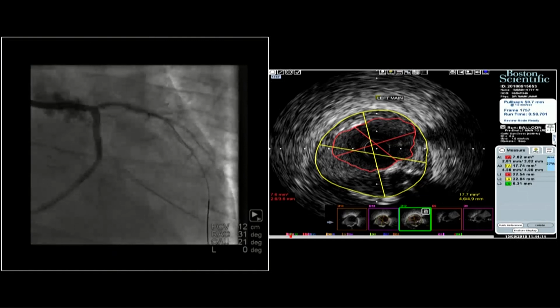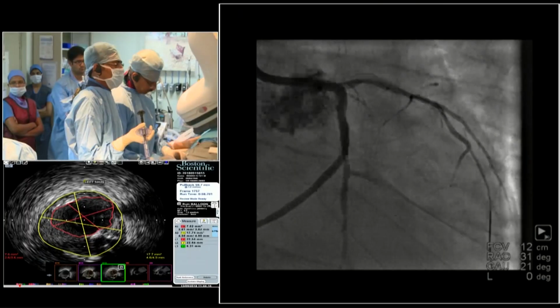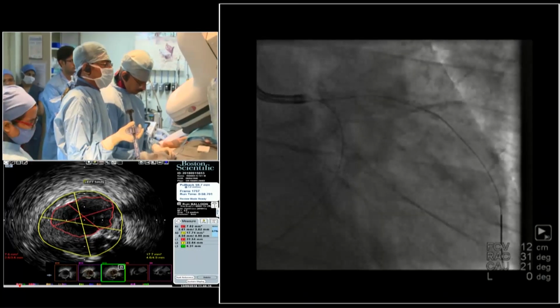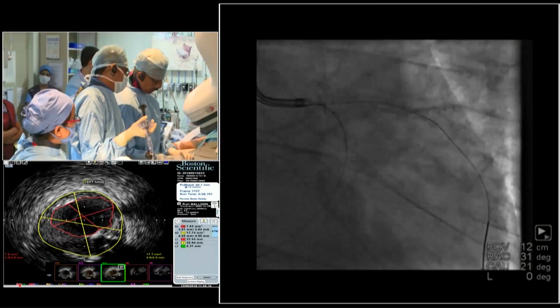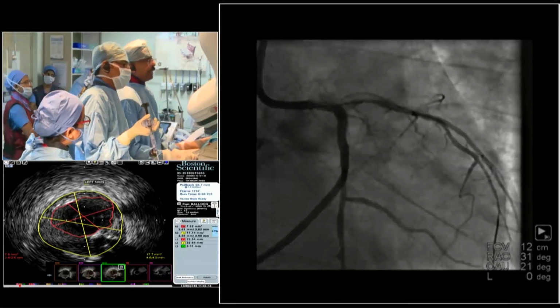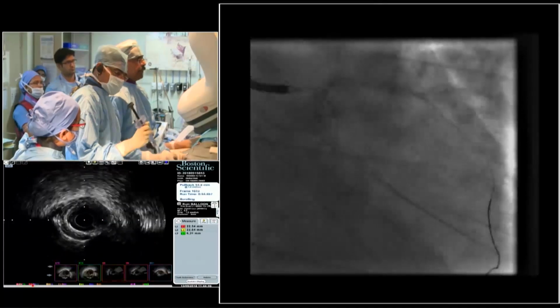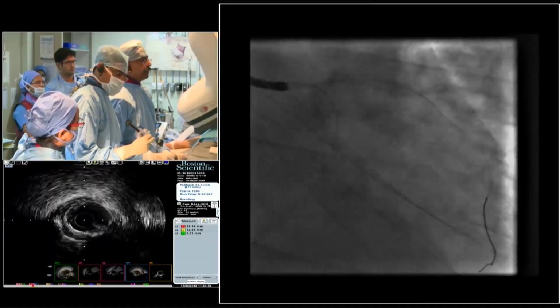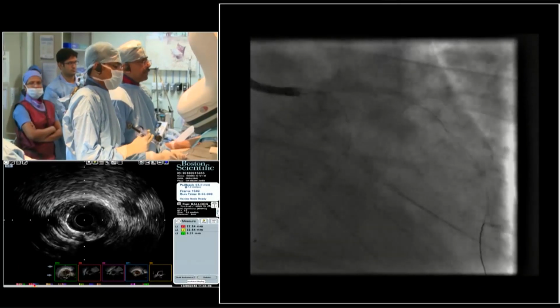So I've just wired the circ. This patient is a little breathless, so he's on Lasix infusion, and we have the intensivist here, but he has been very cooperative as of now. So Vijay, can you just explain about this balloon?